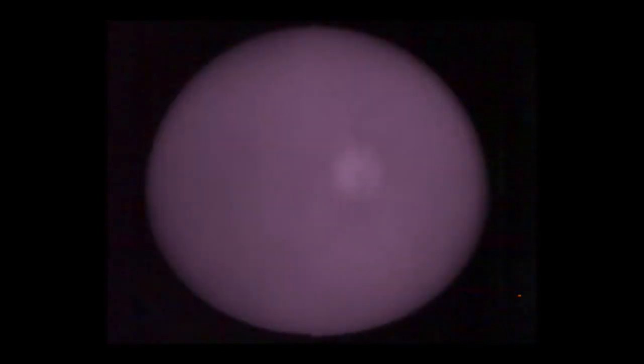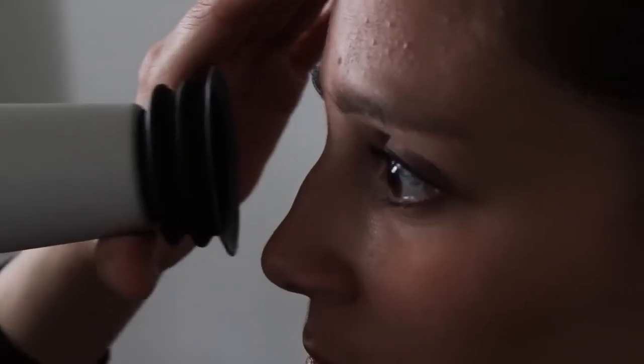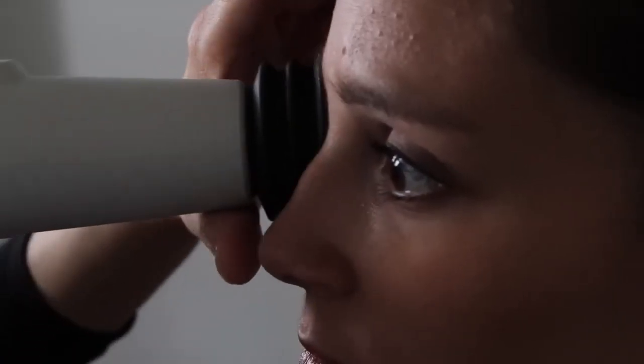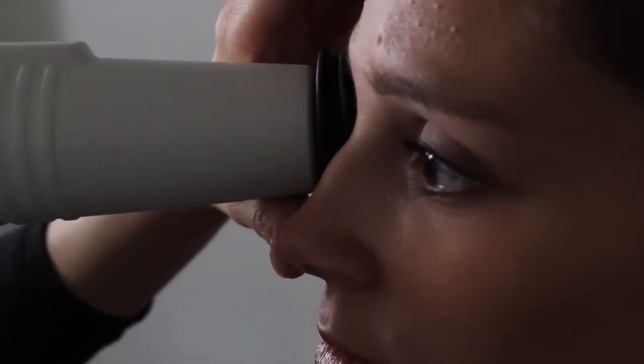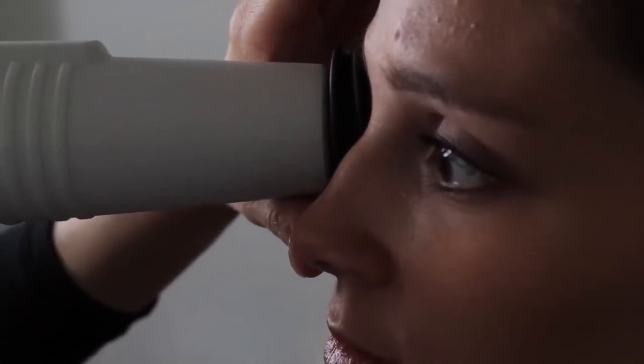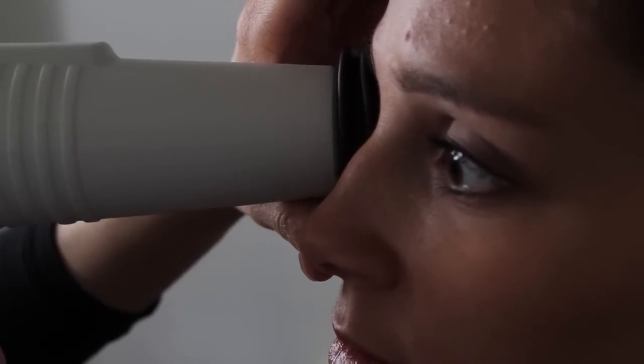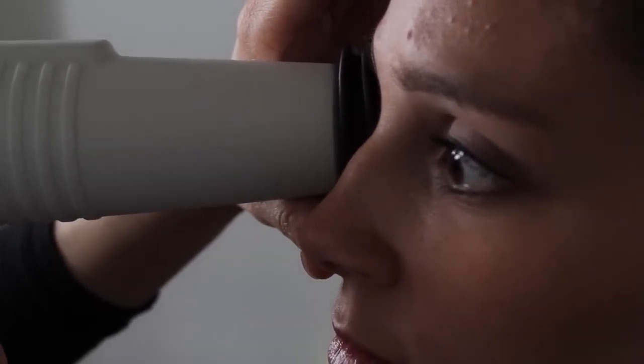Slowly get closer while keeping the view of the retina at the center of the display and close in until it fully fills the viewing area. The optimal imaging distance is when the silicone eye cup is compressed approximately halfway down, which is about 2 centimeters from the eye surface.